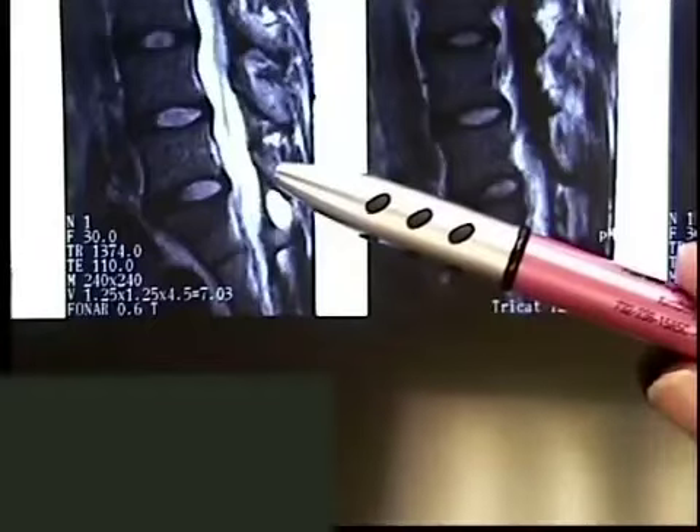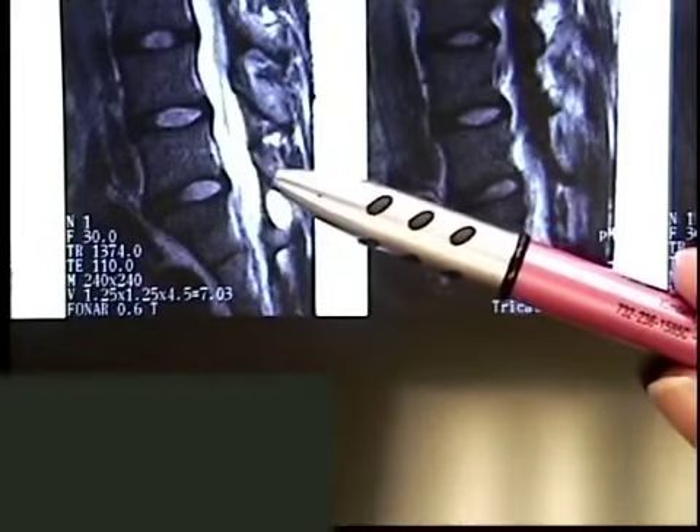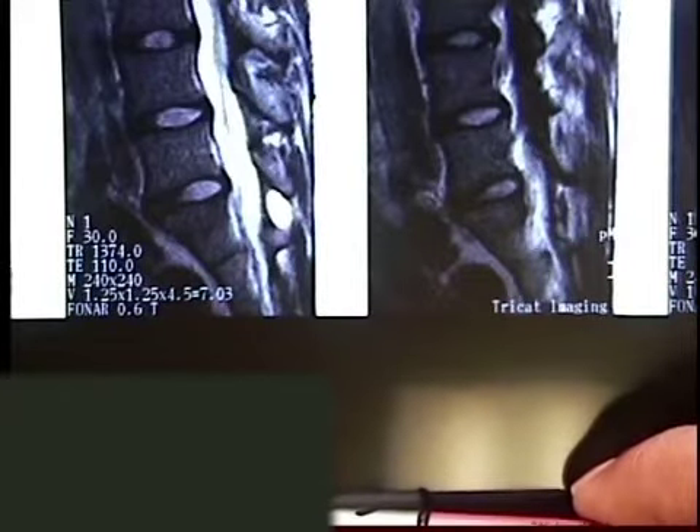Doctor, I know we have films. What film are you looking at right now? This is P2. It's a side view of the low back, the lumbar MRI.